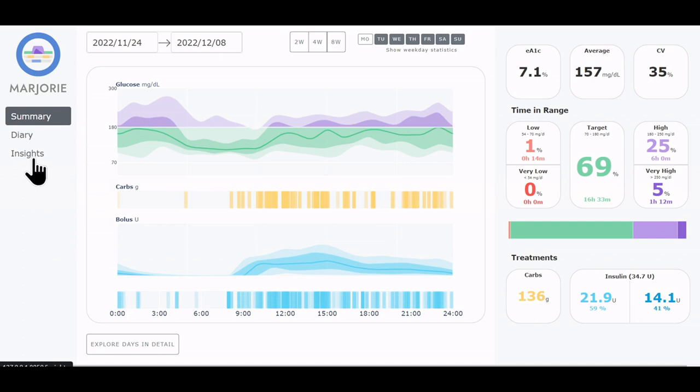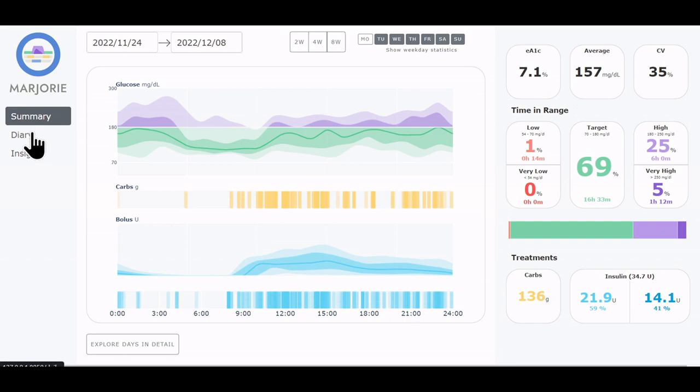The summary view provides an overview of the past weeks. The diary allows users to look up specific days. The insights view aggregates relevant situations such as meals and periods of hypoglycemia.